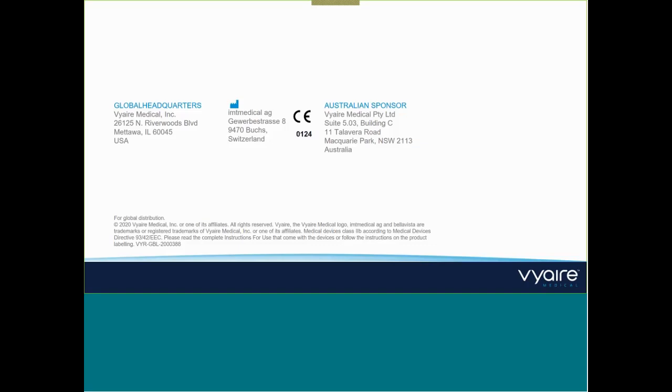You see the End-Tidal CO2, which also gives you the indication if you are hypercapnic or hypocapnic, because this already leads to metabolic information as well. But the main metabolic information, and how is my patient ventilated or how good I am in ventilating patients, will come from the volumetric capnography. And this will be shown in August. Yes, like you already said, next webinar, Capnography 2. Thanks very much, Christian. It will be at the end of August, and we are going to announce it to you very soon.